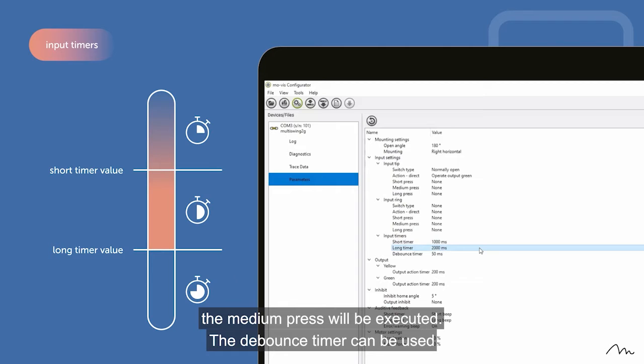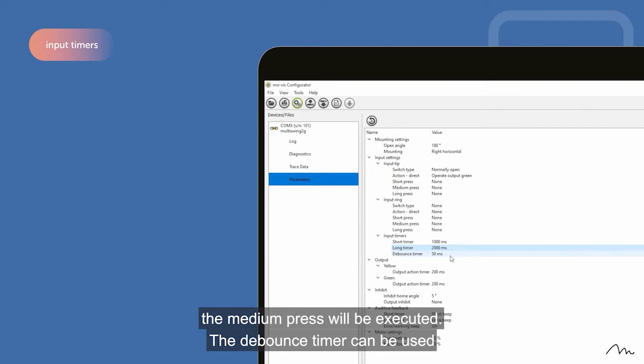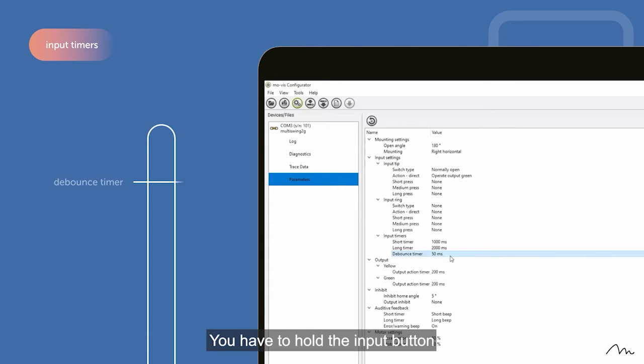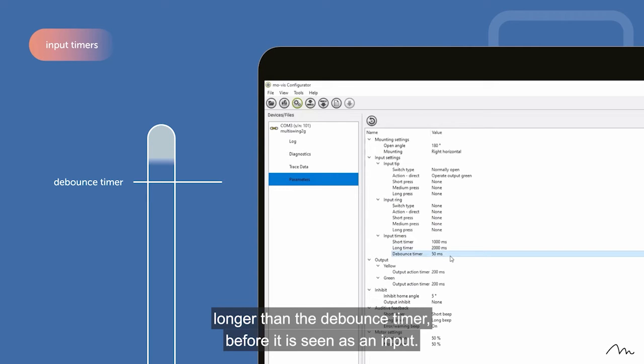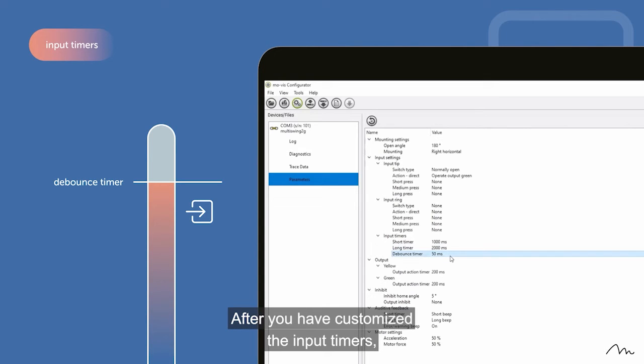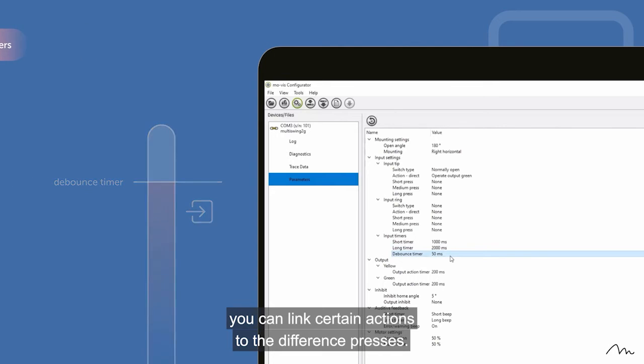The debounce timer can be used for tremor damping, as it reduces the effects of a user's hand tremor. You have to hold the input button longer than the debounce timer before it is seen as an input. After you have customized the input timers, you can link certain actions to the different presses.